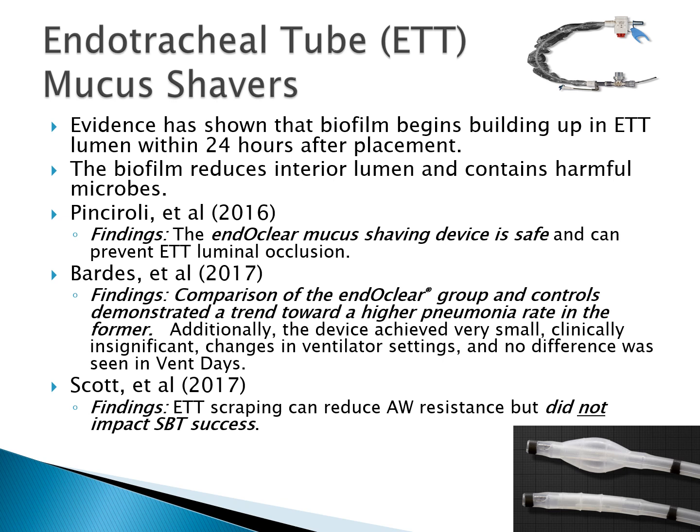Scott in 2017 and his colleagues determined that ET tube scraping can reduce airway resistance, but did not impact spontaneous breathing trial success. So that's kind of an important finding as well. It wasn't a huge study, but it's something to be mindful of.